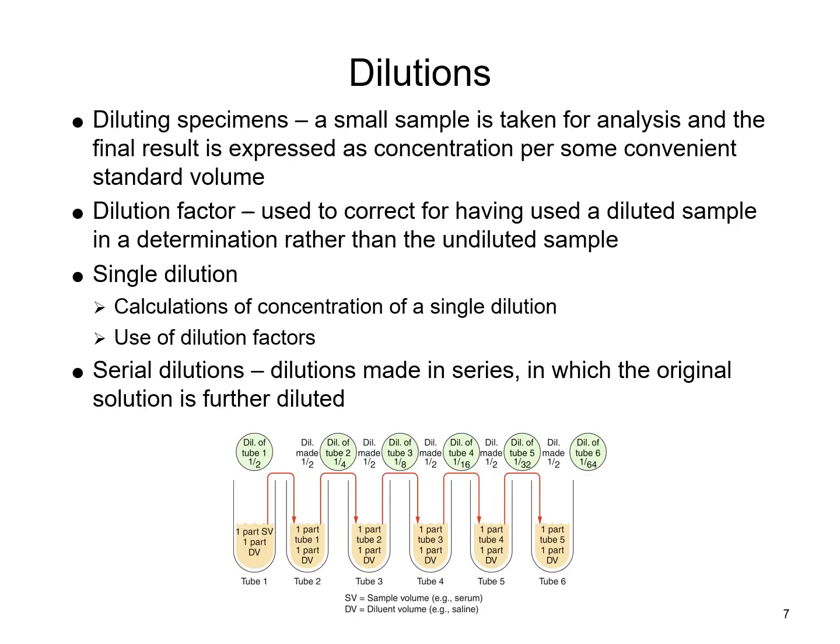It's often necessary to make a dilution of a specimen that we're going to analyze, in order to make a weaker solution from a stronger solution, in many of the laboratory procedures done for serological testing. As a lab tech, you're going to be expected to work with and know various dilutions and be able to figure out those dilution factors.